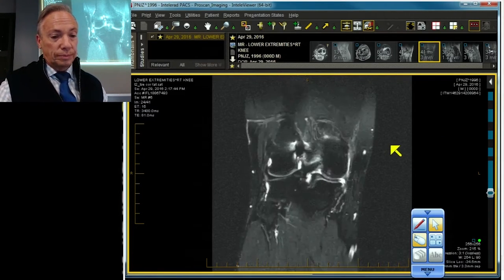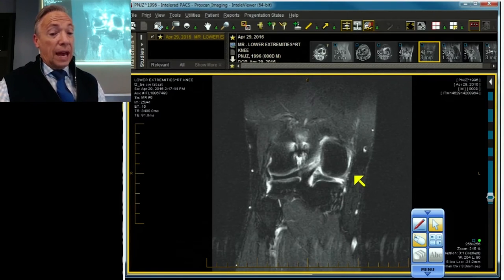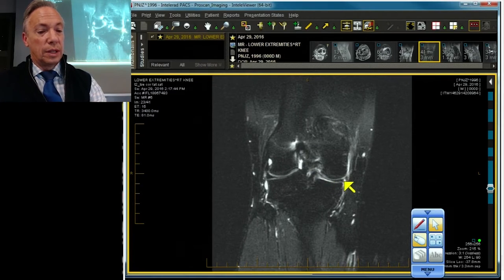Now let's scroll the coronal. Going to the back, all the way in the back, we're actually missing a piece of the posterior medial corner. There's the meniscus with the meniscus root. Going forward: meniscus with a little vertical tear in it, and at the capsule there's a fragment.